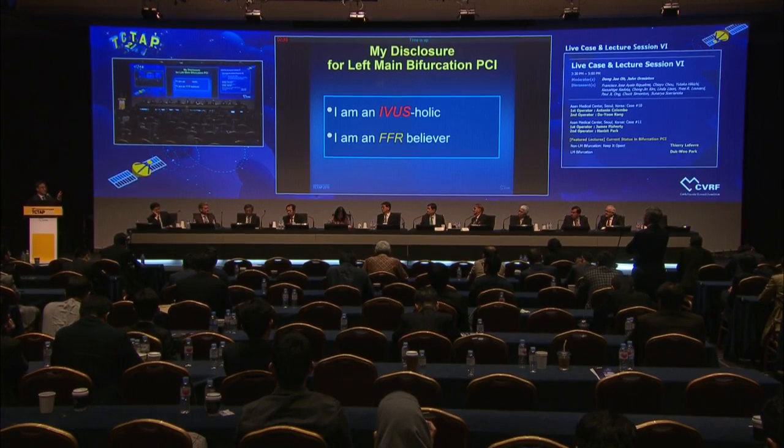I have one question for the masters of bifurcation, Lefevre and Louvard: how do you expect the result of the EBC MAIN trial, given that in the DK Crush V trial, two stents was better than provisional stenting?